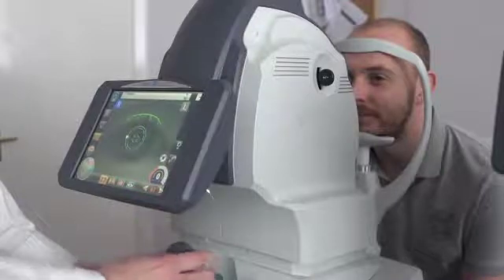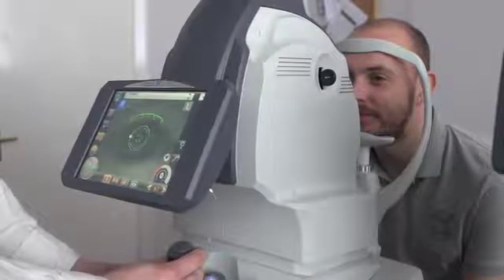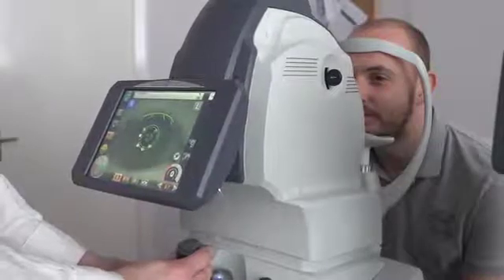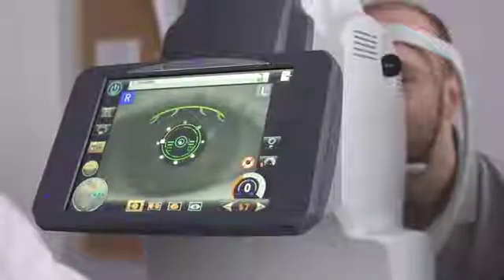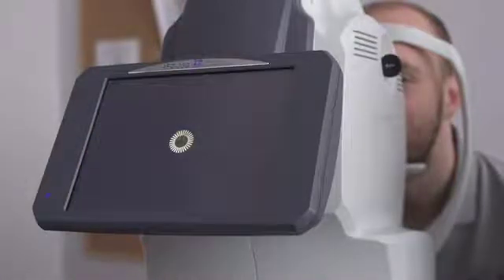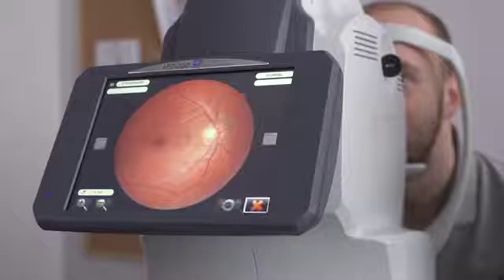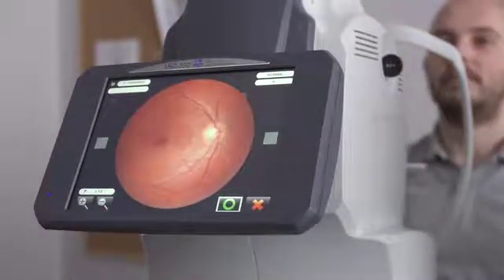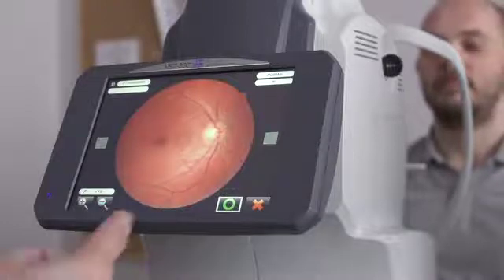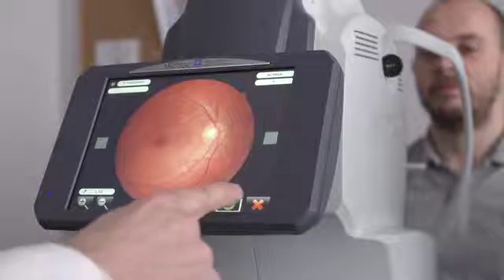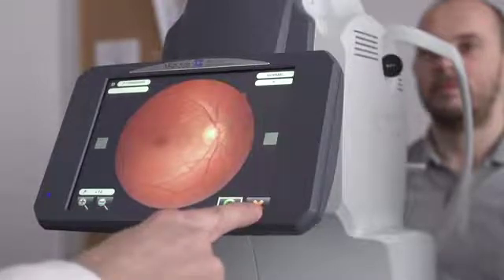To take the photo, all we do is move towards the eye centering on the middle of the pupil. At the point of alignment, the AFC330 will take over, focus and take the shot. And as we can see, everything is beautifully in focus. If we are happy with a shot we just press the green circle. If we are not happy for any reason, we press the red cross.